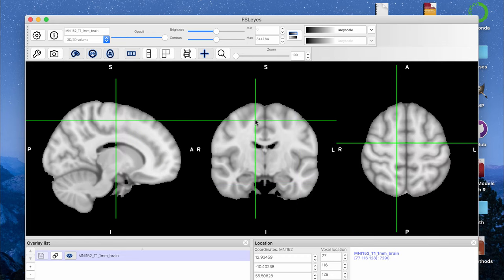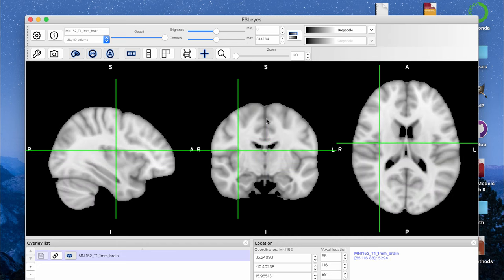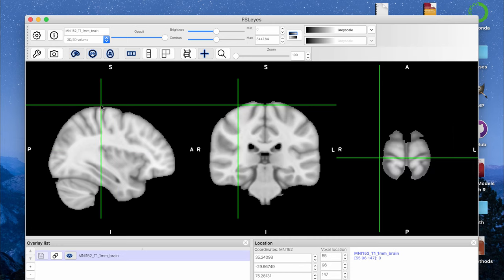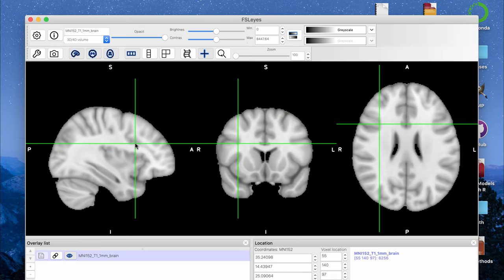What a brain mask is, it binarizes the different voxel locations. It's going to give each voxel location an intensity value of either 1 or 0, and when you replot it, it's going to fill out a white looking mask. These binary brain masks that you can create are then usually used later on for ROI studies. If you have a region of interest, maybe from an fMRI map, you can create a brain mask of that one region and then use it for later ROI analysis.